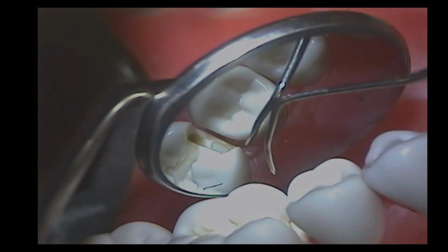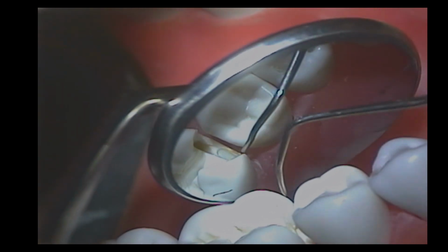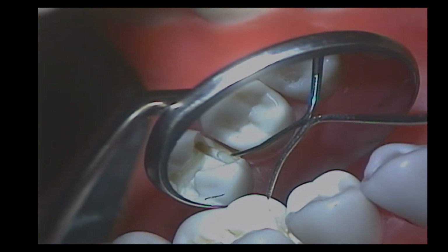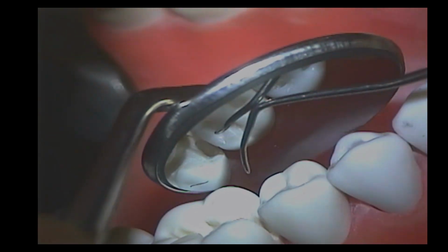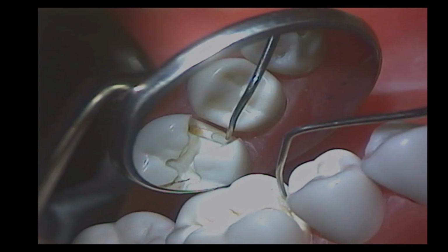So for example, the divergent part of the wall, which is the occlusal third, has an exit angle. When I'm looking down the wall, we can see the exit angle, and it's probably a little bit acute. It's subtle. Probably I'd rather have it more like this angle. That would be more of a 90-degree angle. But again, we only see the exit angle when we're looking exactly down the wall.